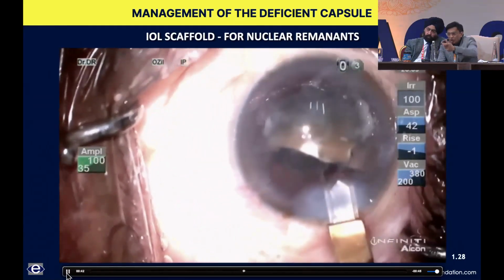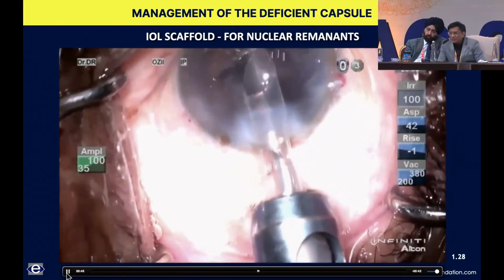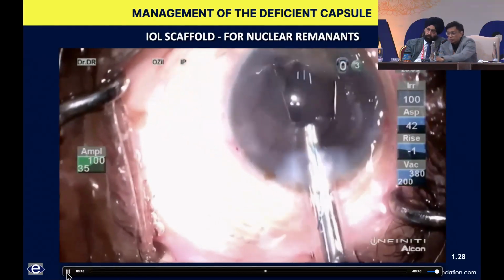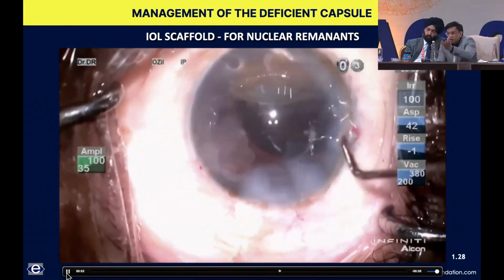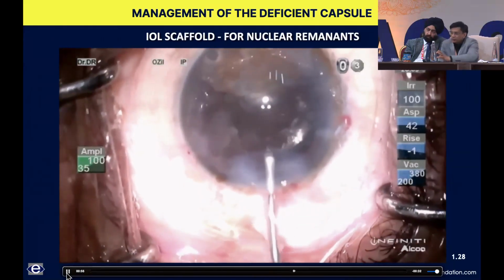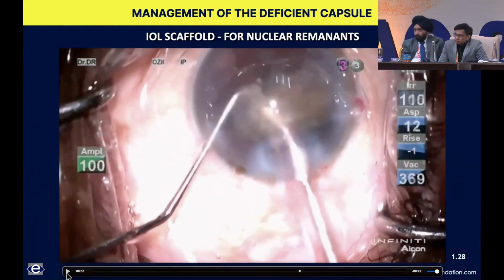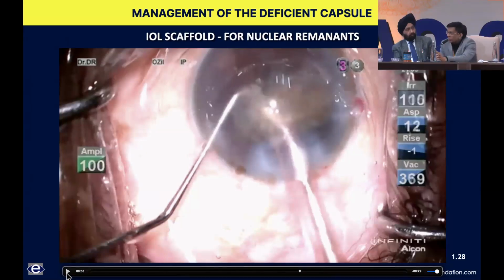And these are trocars, AC maintainer. So when you pull it out, it just automatically seals by itself. Just a small thing to tell you all, so that your left hand doesn't get restricted and it's totally free. You have fluid continuously flowing inside the eye. Good tip. So you will always have a trocar in these situations? Yeah, I always fix a trocar AC maintainer, because once it's fixed, it's permanently there. Just like a retina trocar, but I'm not going below the iris, I'm going above the iris.